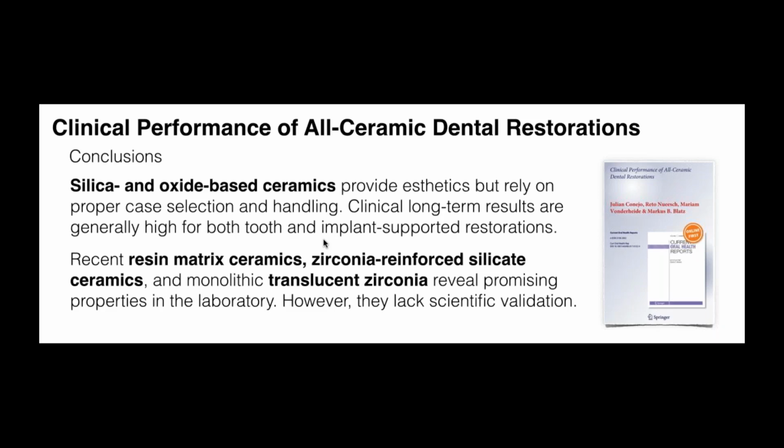And of course, with newer formulations at the beginning, we need to be cautious, but in this case, we're talking about a formulation that has been proven for many years, so we feel confident about using VITA Ambria.